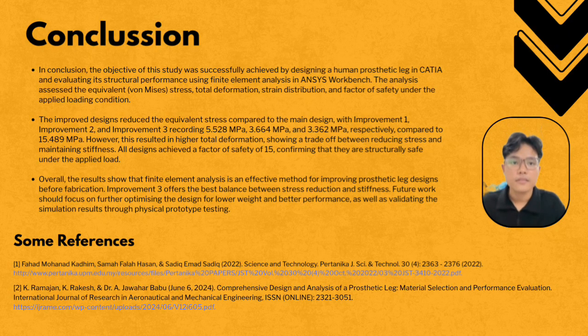Moving on to the improved designs. The improved designs greatly reduce the equivalent stress compared to the original design, as Improvement 1, Improvement 2 and Improvement 3 record 5.52 megapascal, 3.664 megapascal and 3.362 megapascal respectively, compared to the 15.5 megapascal of the original design. However, this resulted in higher total deformation, showing a trade-off between reducing stress and maintaining stiffness.